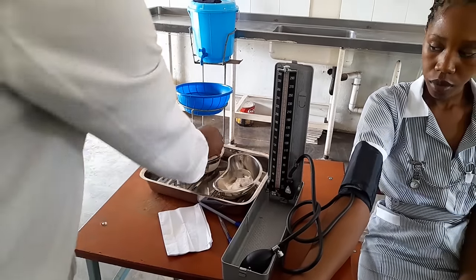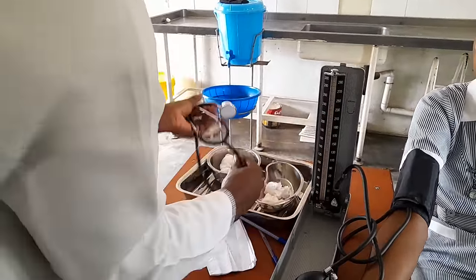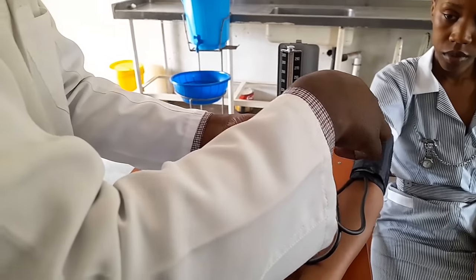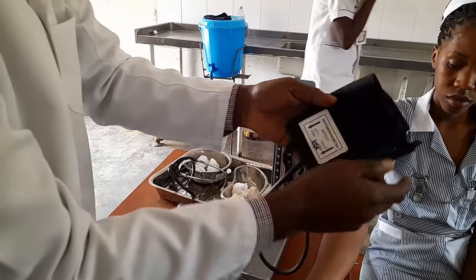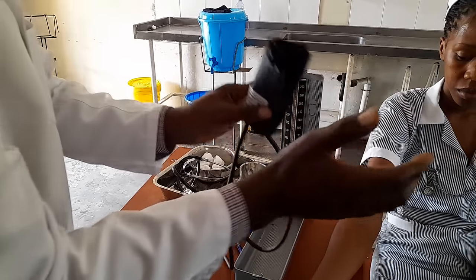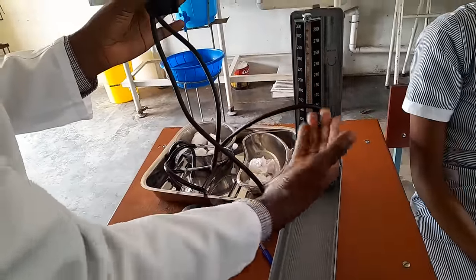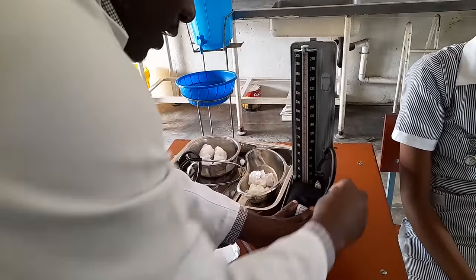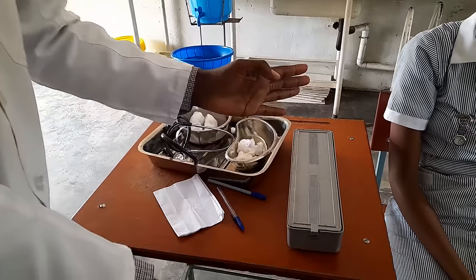Once you're done, clean the stethoscope again with a spirited swab, clean the diaphragm, then place it back on the tray. Open the valve completely to allow excess air to escape, then remove the cuff from the patient. After removing it, squeeze to remove excess air. Then close the valve — never forget to close the valve, because if you leave it open when you pack the sphyg, you'll find that the mercury has escaped. Turn the valve to off, put back the cover and the tubing, then close the case.